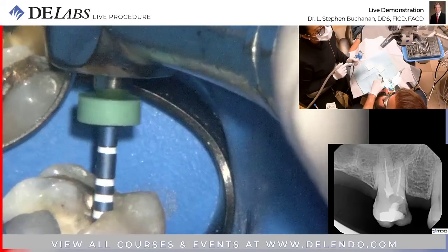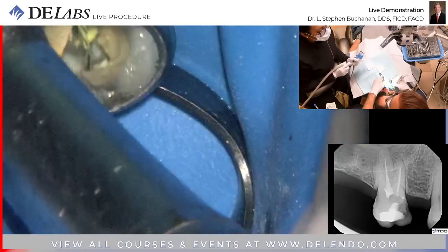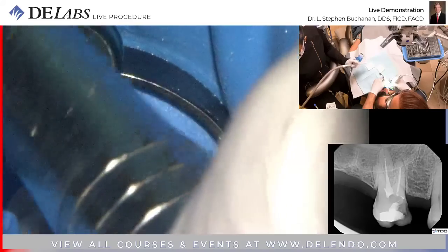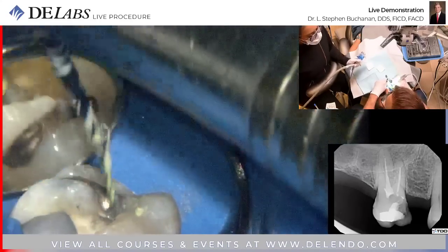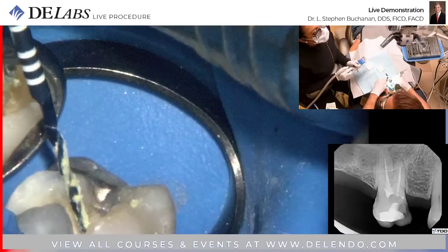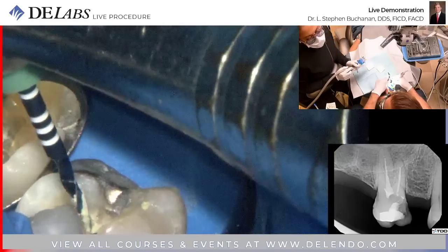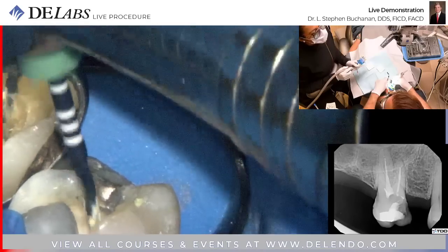Here's the calcium hydroxide that was placed previously. Here's the distal. This is all being done dry. This is dry so far. I'm only in the coronal third or half. And we have some irregularity around the distal buckle, so I'm going to want to tune that up a little bit. There we go.